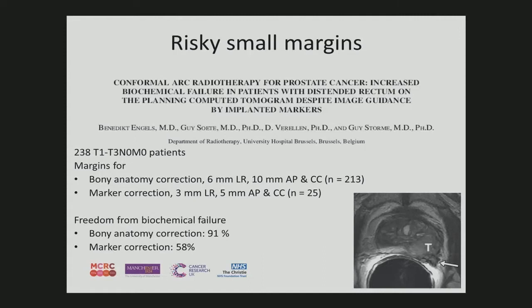and what they found is that in the original treatment with the big margins and less precision, they had a way better outcome than on the more precise treatment with smaller margins. So they went too small. And that is the biggest risk of higher precision, that people overestimate the total chain accuracy. It's not only the treatment machine, and the patient is not a piece of plastic. You have to know about the biology.